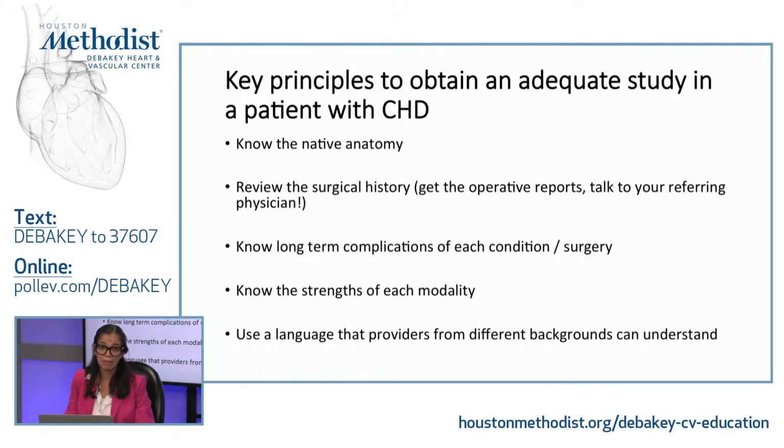Because it's very important to know that these patients take longer than patients with acquired conditions. And if we plan ahead, we're more likely to get a good study with good information and in an adequate amount of time. This is especially important for studies like MRI that require our patients to lay down flat for a long time. Some of them cannot really tolerate it, and it's not ideal to conclude a study without getting the key information, okay?